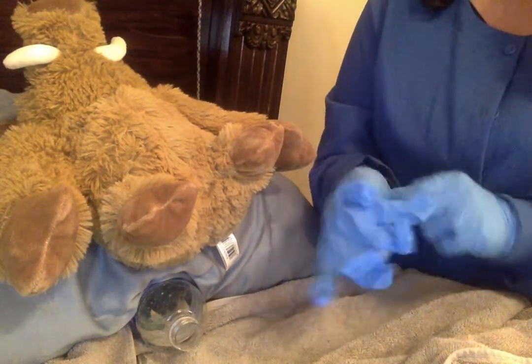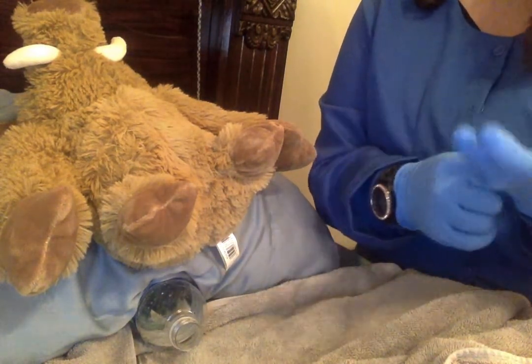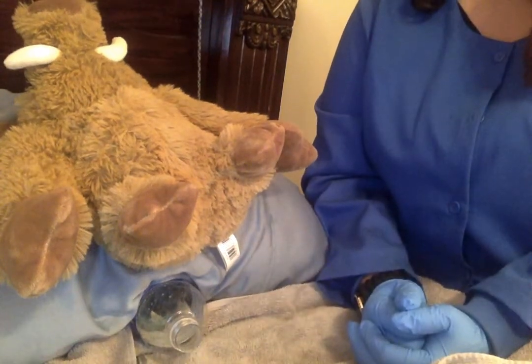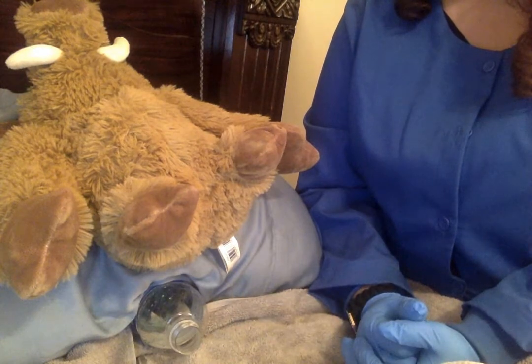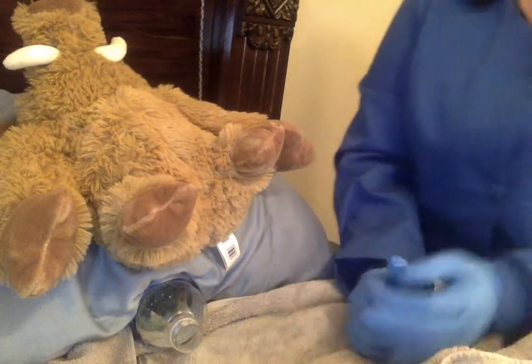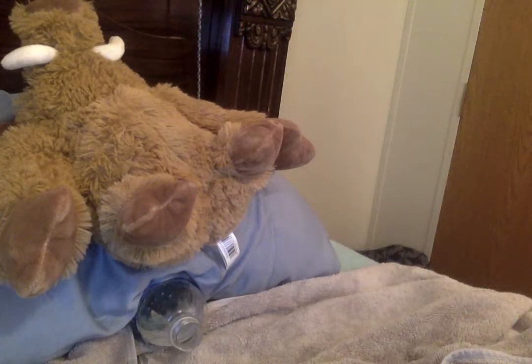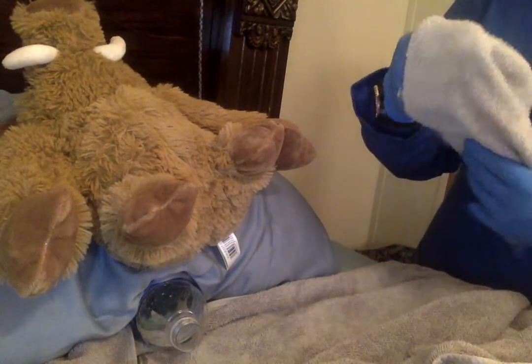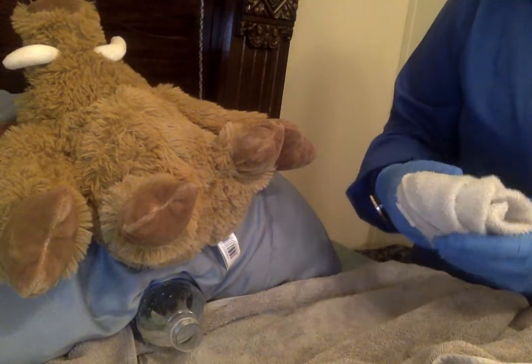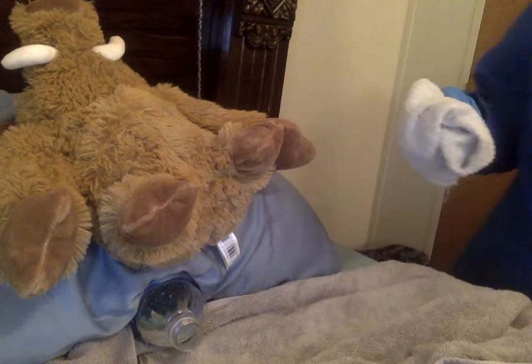What we're going to do now is wash the perineal area with soap and water. Then we're going to clean the labia and urinary meatus, working from the clitoris towards the anus. So we're going to go ahead and do that right now. We have our water and our wash rag. We are going to dip it in the water, make sure it's wrung out pretty good.